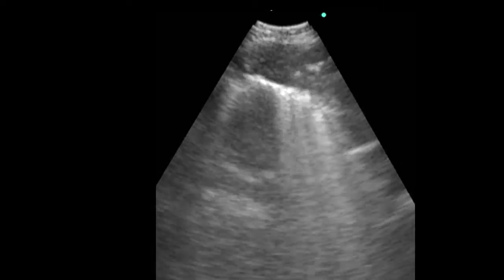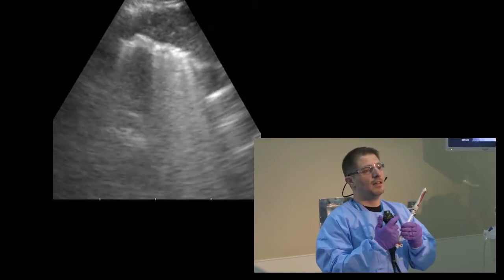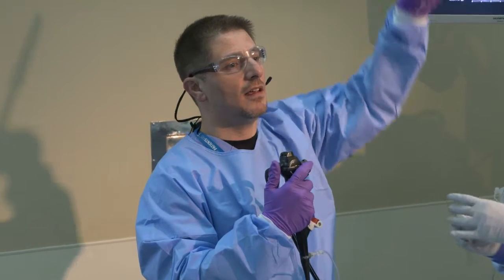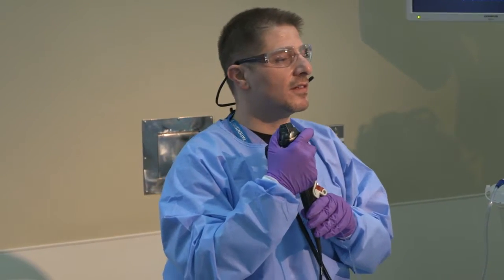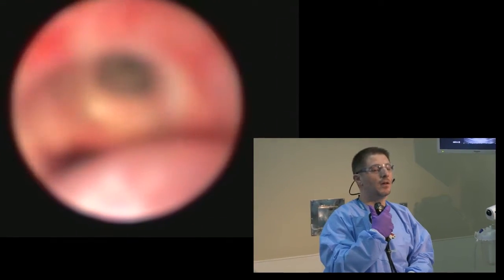Then you pull the needle back, you lock it, and you unlock it from the scope. You pull up to make it straight, and you don't bend it while doing that. Now, first two passes done for on-site cytological evaluation. The other two will be going for cell block, so we'll do it with suction.